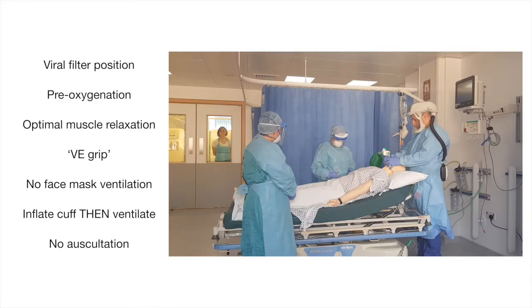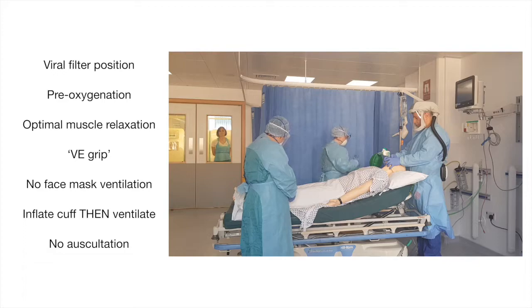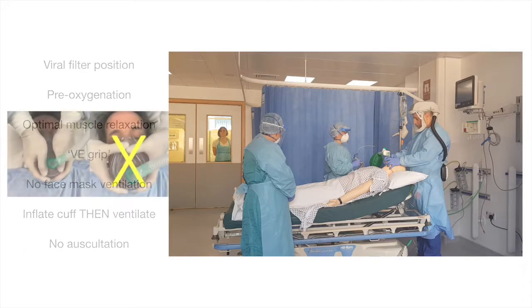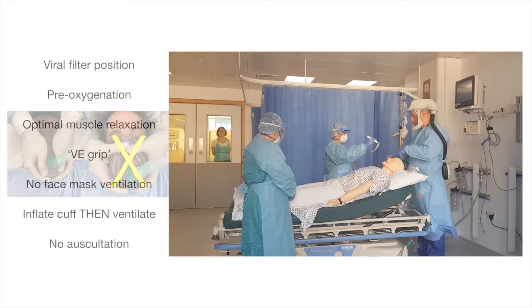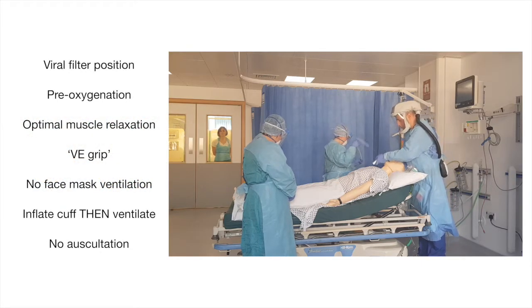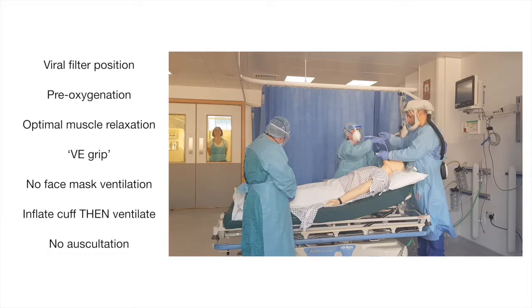Key points here are that the viral filter is positioned as close to the patient as possible in the circuit. Pre-oxygenation is done with a well-fitting mask via the Mapleson C circuit. Optimal muscle relaxation is provided. A good mask seal is maintained after induction using a VE grip, as shown here, to help contain the viral spread. No ventilation via the face mask is given after induction. The cuff is inflated before ventilating the patient's lungs, and auscultation is not done as this risks interfering with the face mask or hood seal.